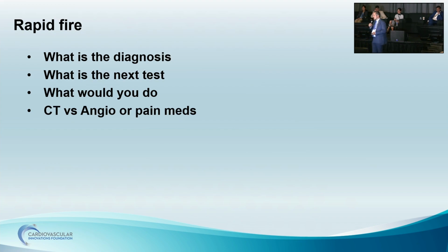And as Dr. Varkes said, the wire crosses easily. That's a bad sign. Whenever the wire crosses easily, my fellow is always excited about that. I'm not. That means there's trouble on the horizon. So what do you do in this situation? Would you do a CT angio, and what are the next steps?